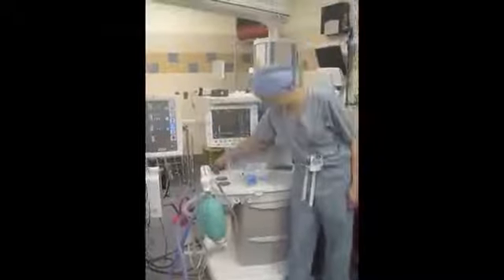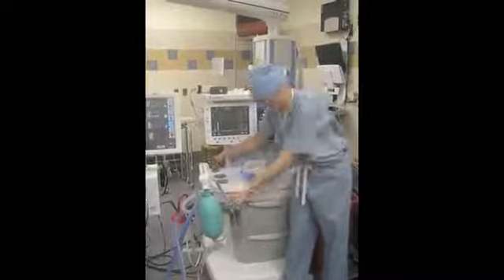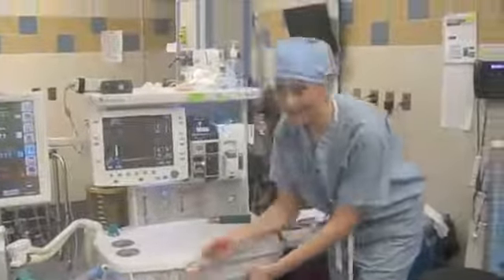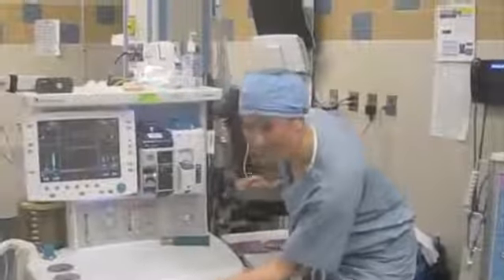Don't forget, close the APL, then O2 flush. Pressure maintained, circuit is clear to continue. Low pressure check, switch to CGO, turn gas on low. Squeeze the bulb and watch the shape hold true.